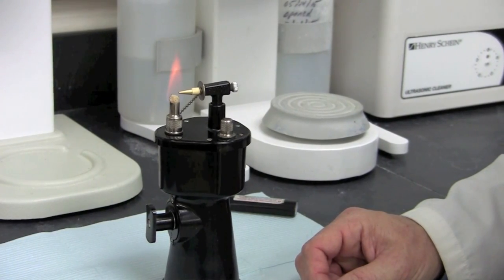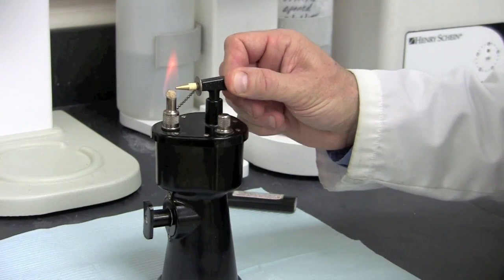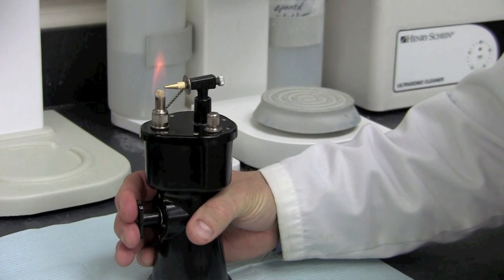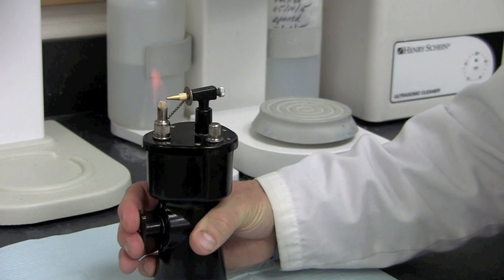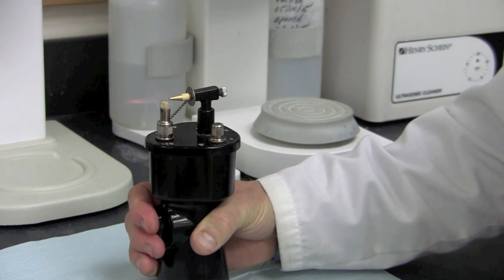If, however, you want a brush type flame, simply turn the thumb screw completely counterclockwise and open it up. Then begin your pumping action — that will create more of a brush type, broad flame. The intensity of the flame is controlled by the pumping action.